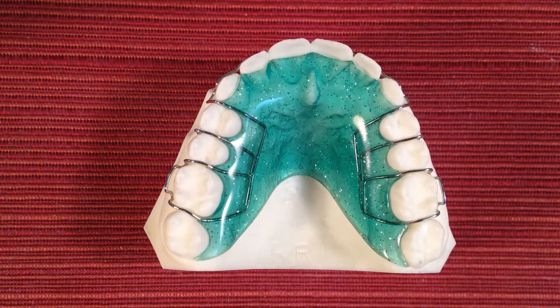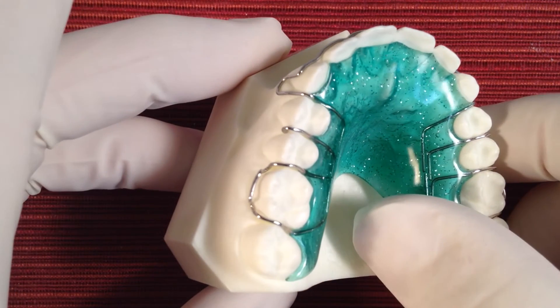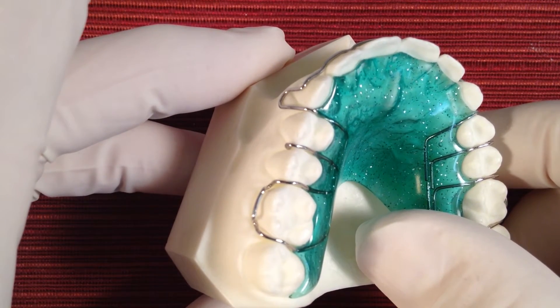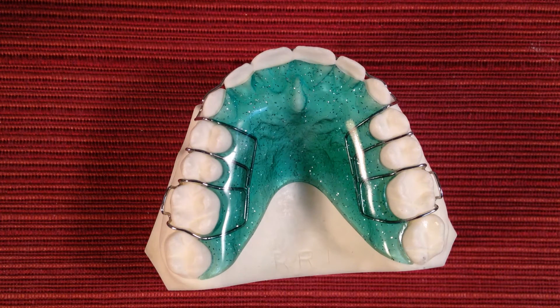Here is an older style traditional retainer. Traditional retainers have pros and cons. One of the pros or advantages is that it is made with a hard acrylic plate that is very strong and durable, and this plate can be polished smooth like glass so that it is very comfortable for your tongue to rest on. Another pro is that clasps can be attached to the acrylic plate to hold the retainer in your mouth so that it doesn't fall out and so that you are not flipping it up and down with your tongue. It is very important that your retainer stay seated firmly in your mouth so that it can do its job.